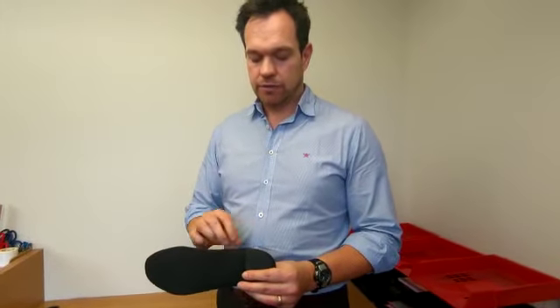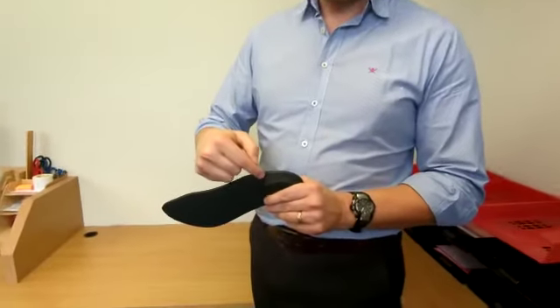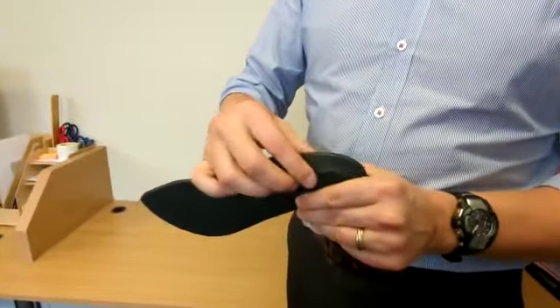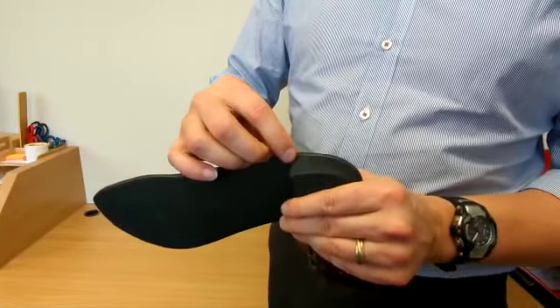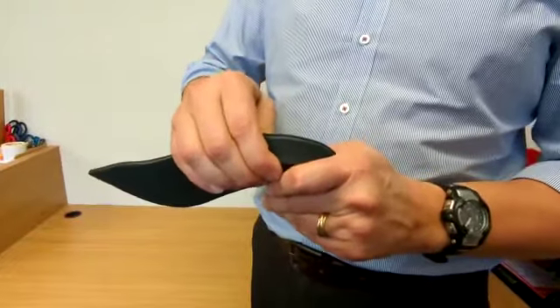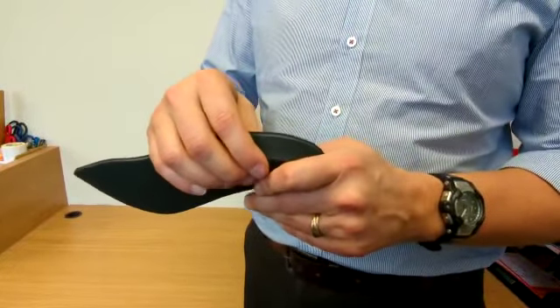The next thing to look for is signs in the material. If material has been added to your device, that can compress over time. You'll see little creases and lines in there that show it's been compressed, and that might need refurbishing as well.